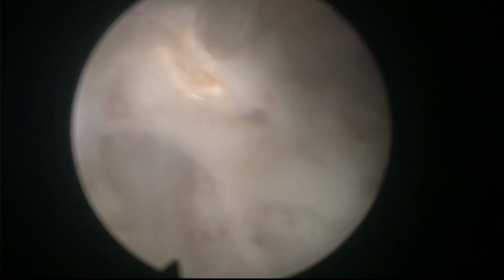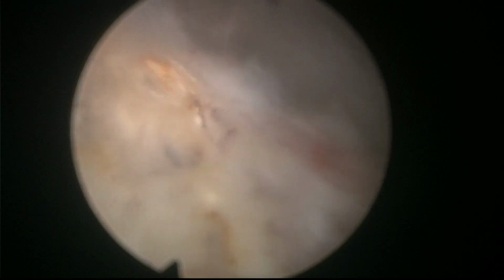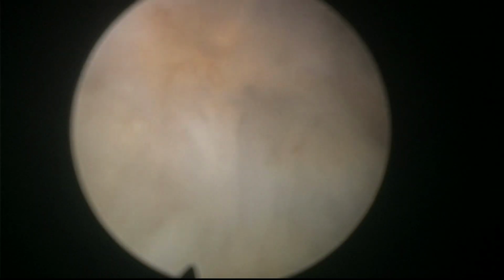See, these nodules thin the capsule a lot, so you have to be careful. Okay, this also maybe is another nodule. Well, it's a very large gland, and we don't want to, of course, lose a lot of time and get carried away with small details, you know, but I'm quite convinced that it is worth it to remove this nodular yellow tissue if you can.